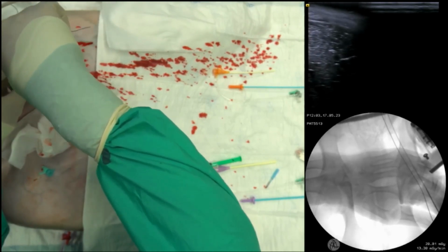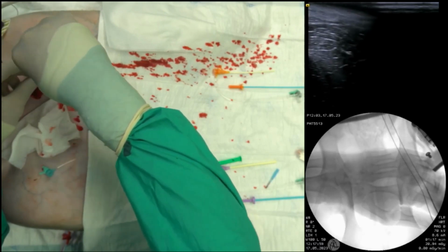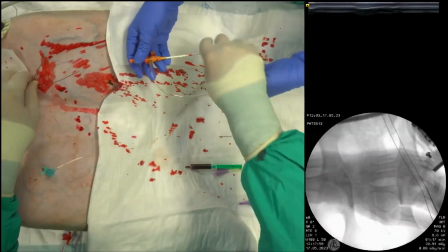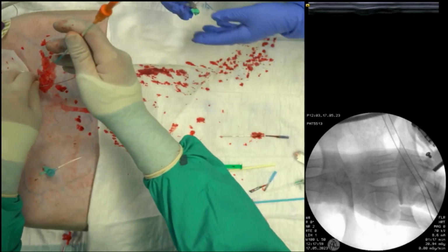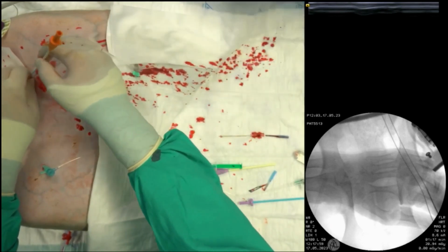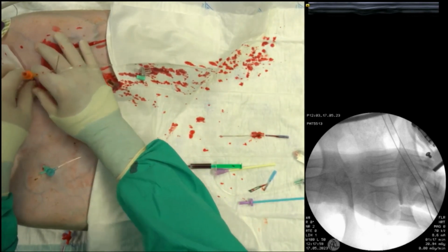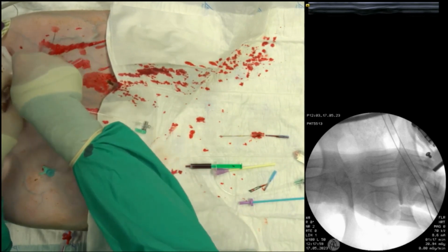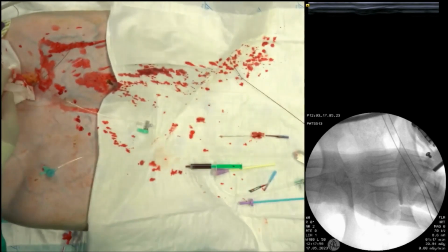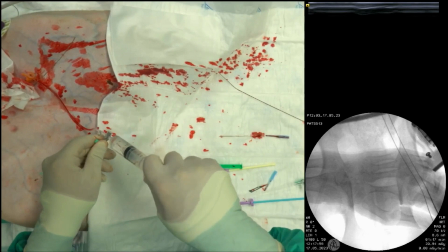And then similarly, we advance the guide wire into the artery a sufficient amount to safely remove the needle. Once both guide wires are in, we can then advance our introducer sheaths. For smaller introducer sheaths, which is this case, a 7 French introducer sheath, we don't need to pre-dilate our path, so we can just directly introduce the sheath. But for larger introducer sheaths, which will be the case of the femoral vein introducer, we should dilate before.